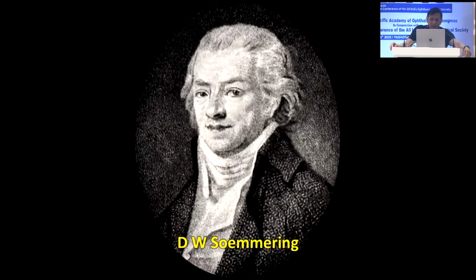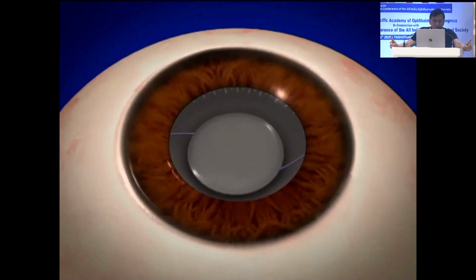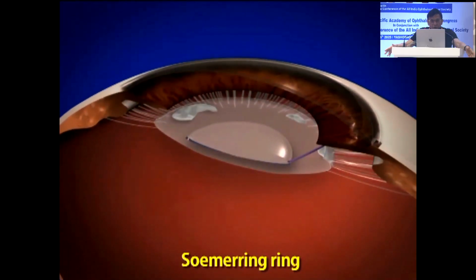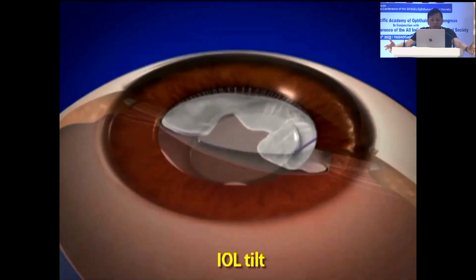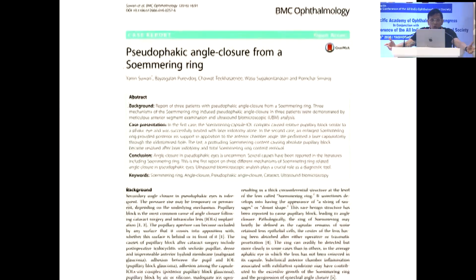Now remember, the second problem here is the Soemmering ring. The problems with Soemmering rings are, one, they can produce an IOL tilt. Second, they can fall down. Third, they can produce inflammation. So the question is, can we leave them behind? No, remove them. Now, when there is no capsule, how will you remove them?